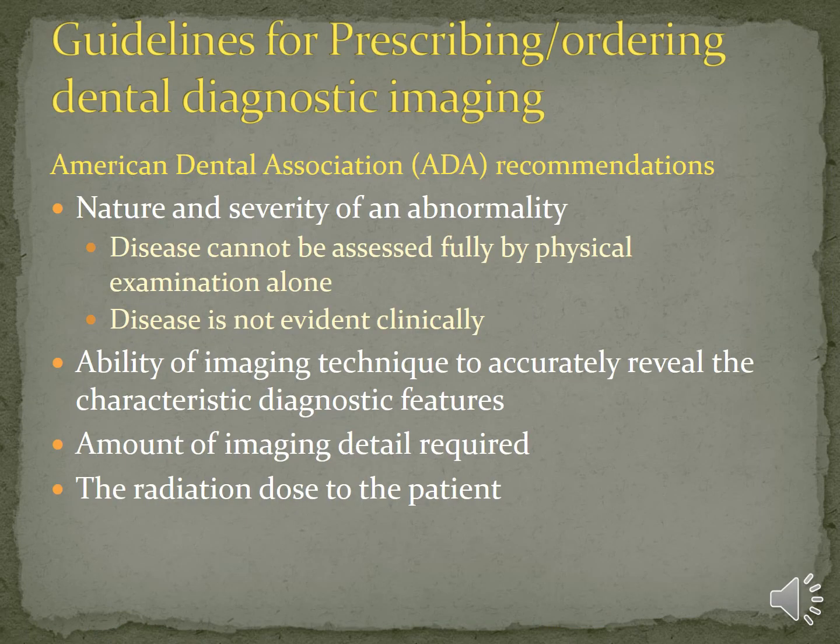Right, so that nearly brings me to the end of the chapter, which I'm going to end with some guidelines for prescribing dental diagnostic radiographs. This is based on the recommendations from the American Dental Association. When do you generally ask for x-rays for a patient? It is based on the nature and severity of the abnormality or the disease that you're looking at. You have a patient in which the disease cannot be assessed fully by physical examination alone.